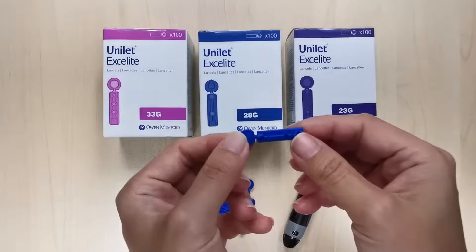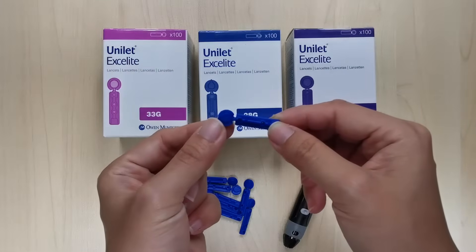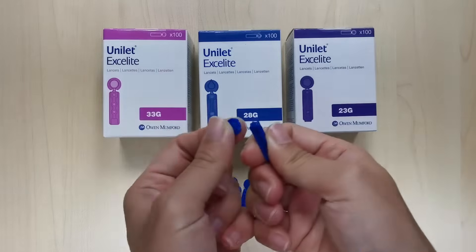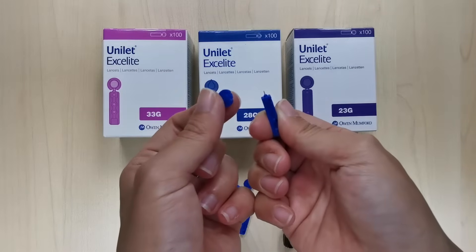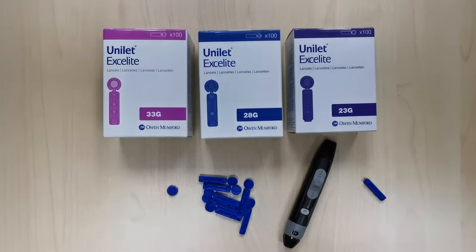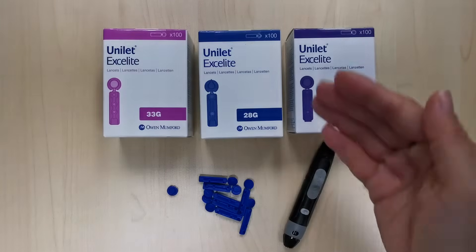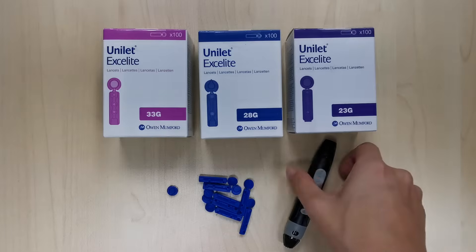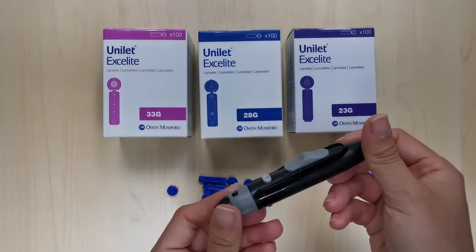In my hand is a lancet. It consists of a lancet needle for pricking and a lancet cap to maintain its sterility before use. Lancets usually come in a box of 100. Make sure your lancet is compatible with your lancing device — the Unilet Exalight fits most capillary lancing devices.